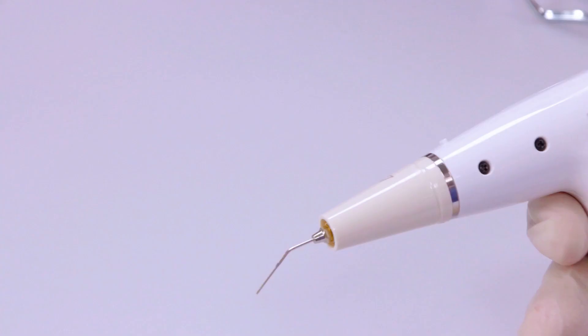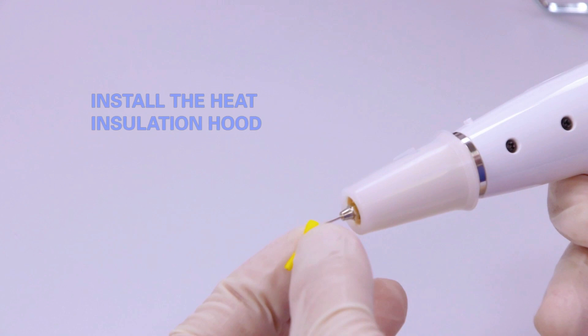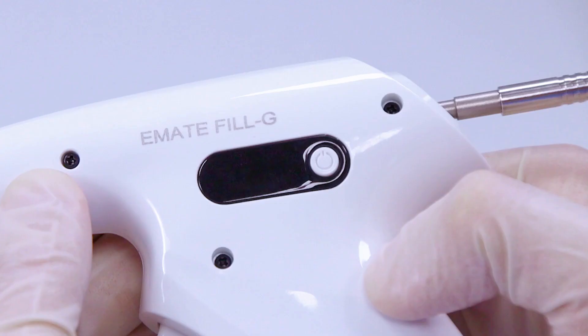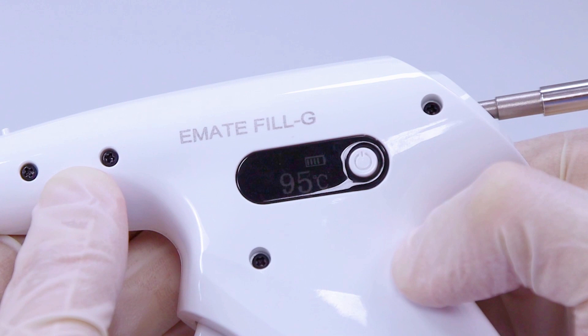Install the heat insulation hood. Long press to switch on, then short press to select the pre-setting temperature.